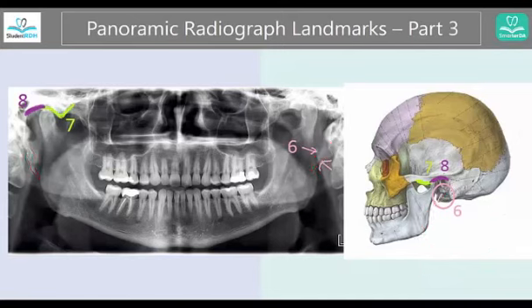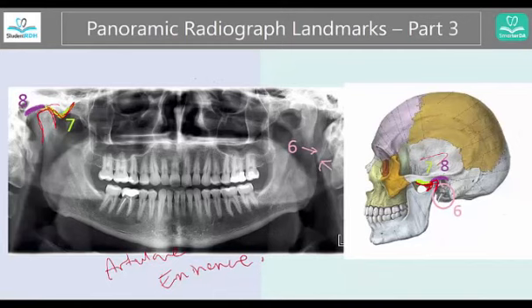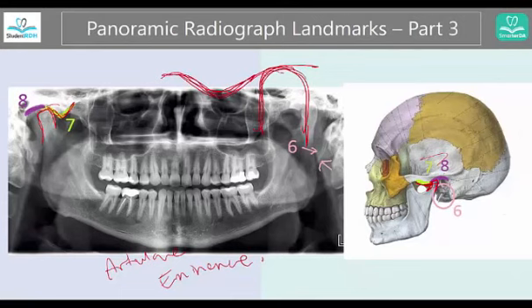Now let's look at number seven. Number seven is this area. You first have to see the condyle — the area in the mandible that articulates with the temporal bone to form the TMJ. The area before this condyle on the temporal bone is called the articular eminence. Eminence means it's protruded. When you have this eminence, a fossa, and the condyle, as you open and close your mouth, the condyle rotates and moves. This little bump prevents the condyle from moving too far forward, which would cause a lockjaw or dislocated mandible. It's called the articular eminence, and it is part of the temporal bone, not the mandible.